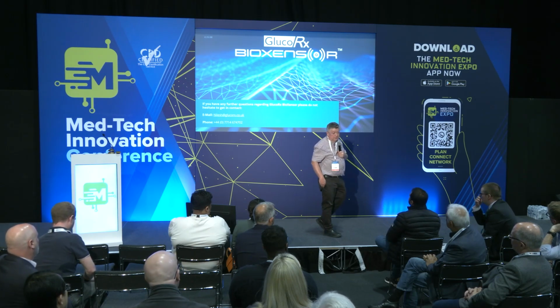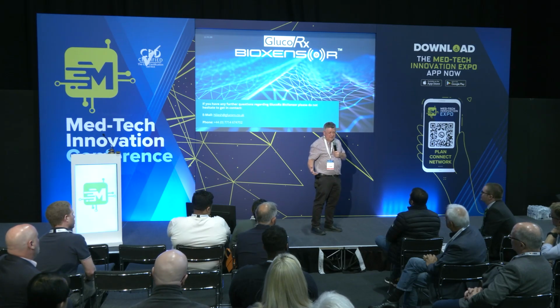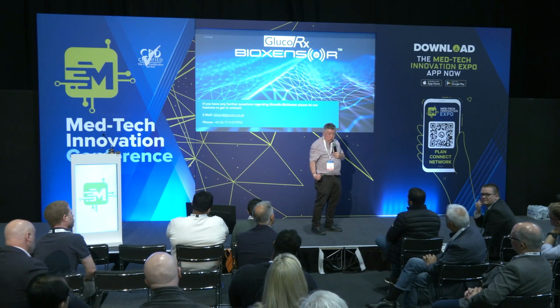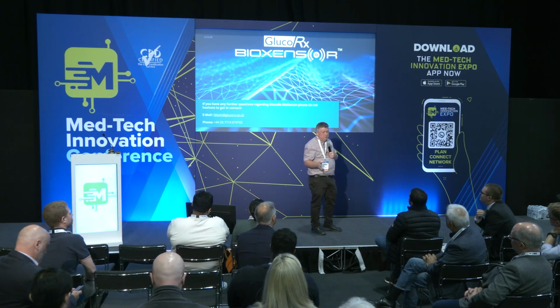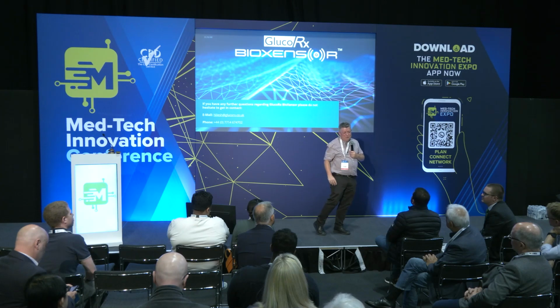We don't actually. The proof of the pudding is in the eating, in terms of what we correlate it with. We're correlating our measurements with those of a blood glucose analyzer, and we're getting that sort of level of correlation. So I think we are measuring the dielectric property of anything that we put underneath our sensor. But there's certainly a large blood component that we are picking out, and that is being traced in our data. Absolutely we're measuring interstitial fluid as well, because everything under the sensor, it's not going to pick out blood only. It's just going to measure everything that it sees.